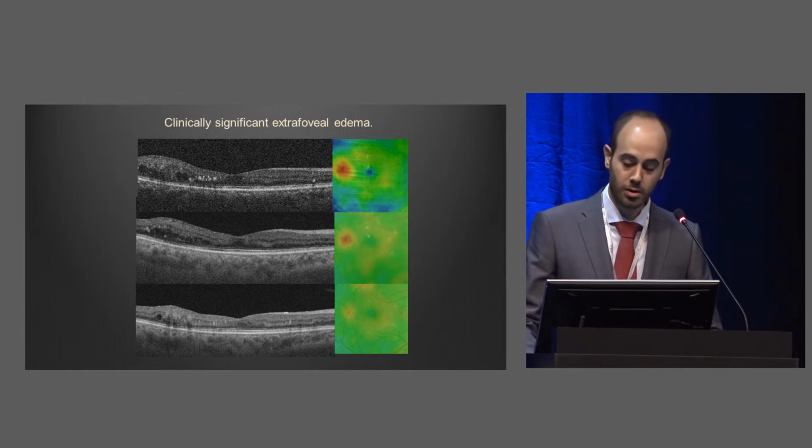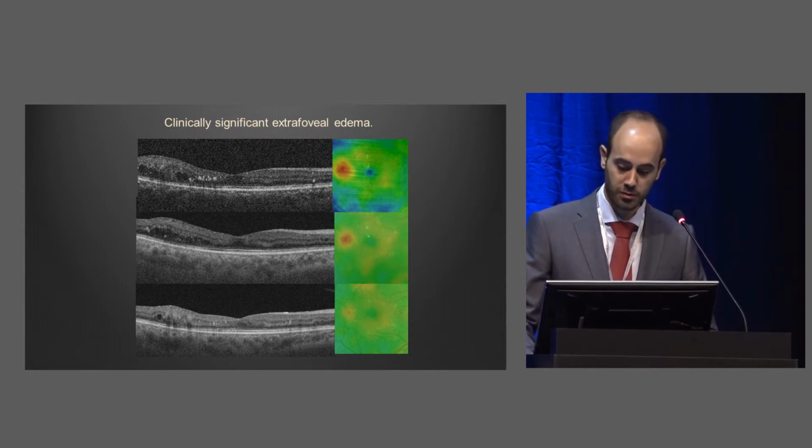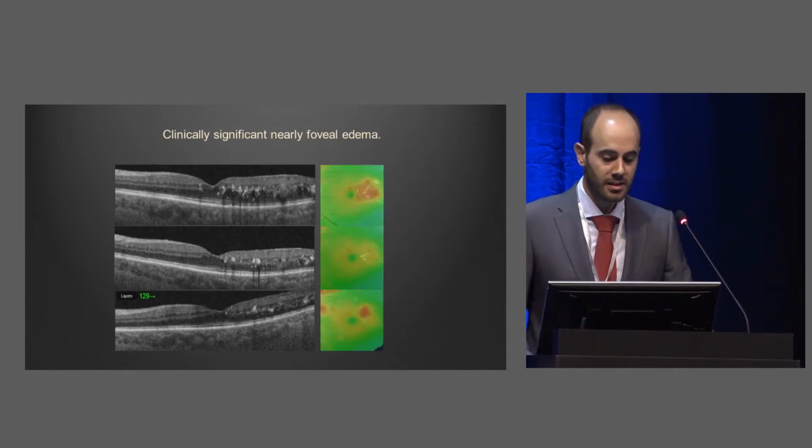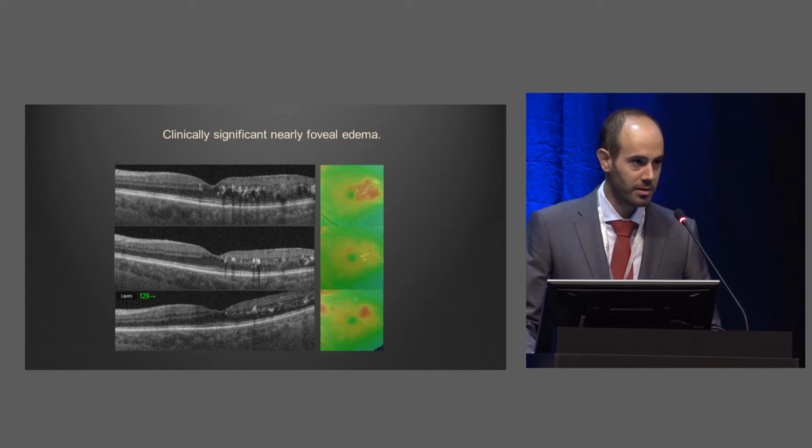If I don't say the contrary, the images are 1 to 12 weeks after the operation. So 12 weeks response, 24 still a little bit more, with an untouched RPE. This is a clinically significant, nearly foveal edema. It will be maybe a harder decision to use conventional laser here. We laser this area and a little bit of the surroundings.